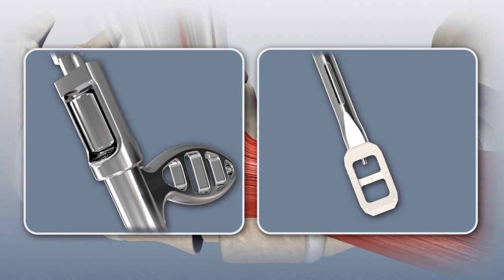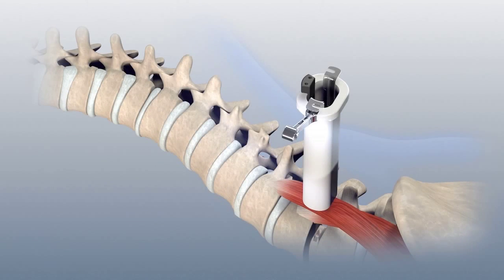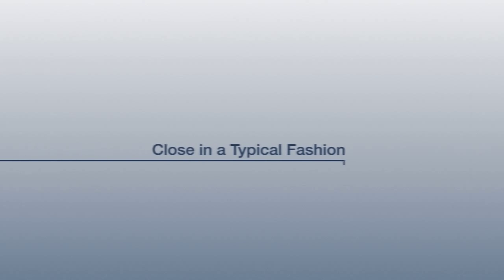Confirm cage placement prior to releasing it. To release the cage, rotate the knob counterclockwise and the sleeve 90 degrees while maintaining downward pressure. Remove the stadia-mounted light and lift up on the arm of the inner sleeve to remove it from the surgical site. Gently remove the psoas retractors from the site one at a time.